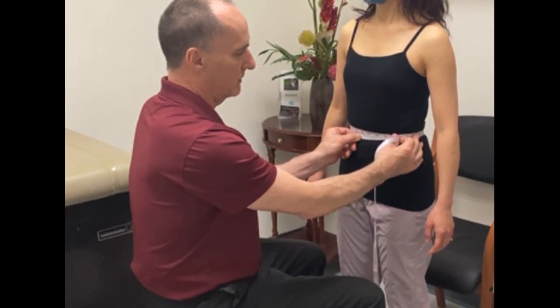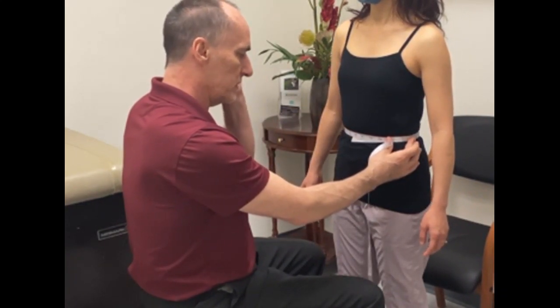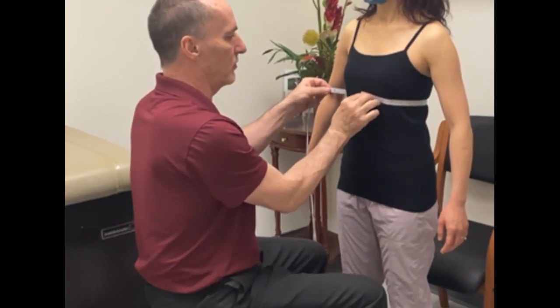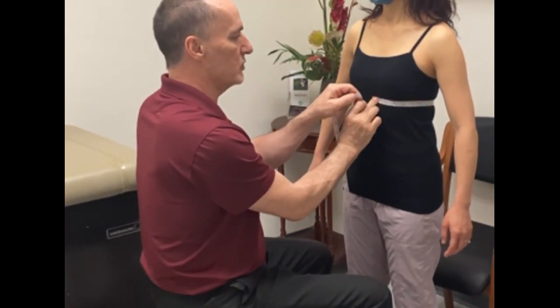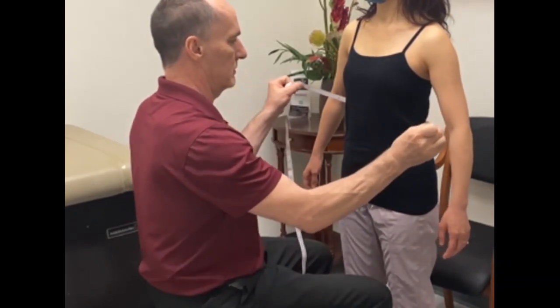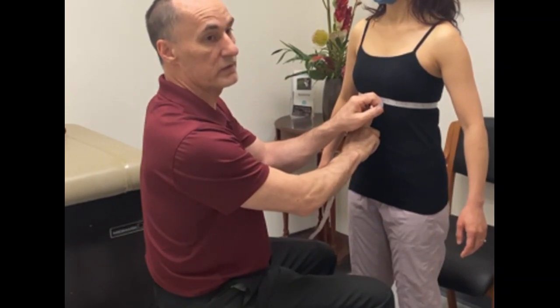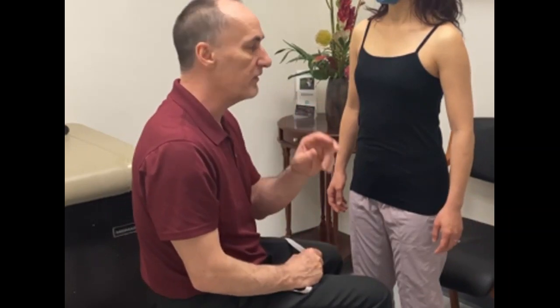Now you have two more levels to go. Take a costal measurement and a xiphoid measurement. The xiphoid measurement should be right at the xiphoid, just below the breast. Your costal measurement should be halfway between the xiphoid measurement and your waist measurement. That covers all your circumferential measurements.